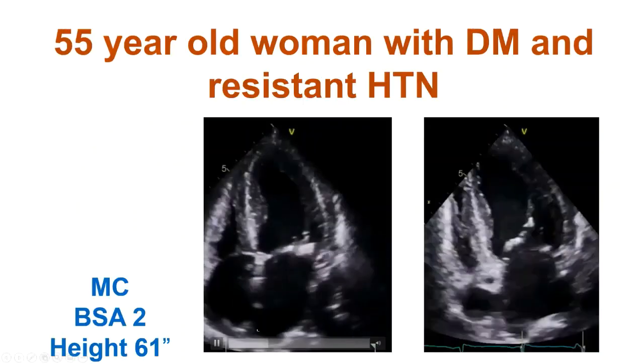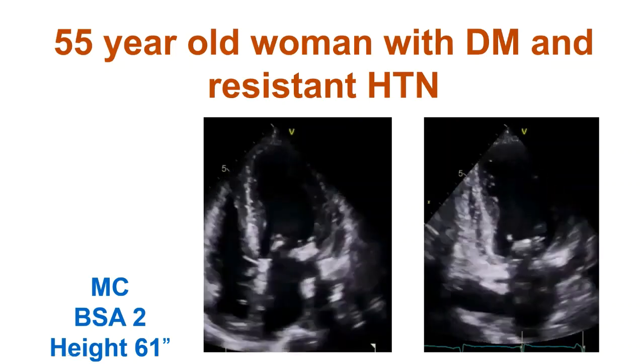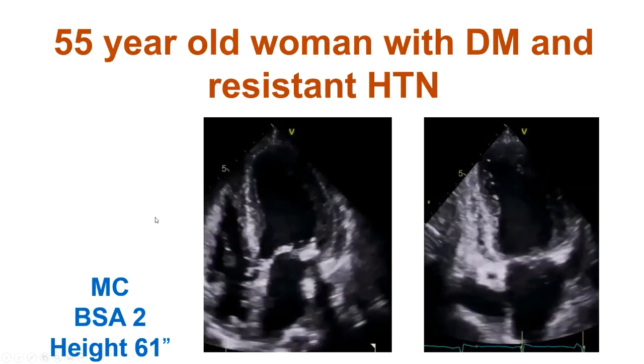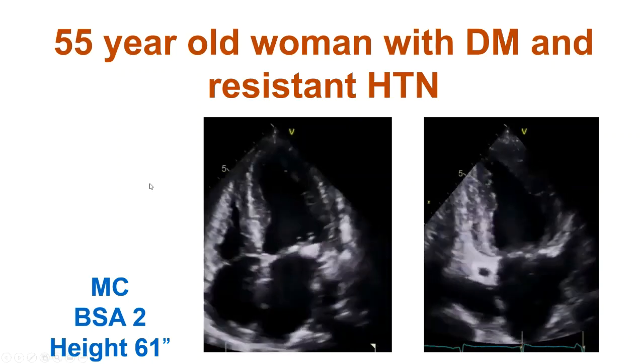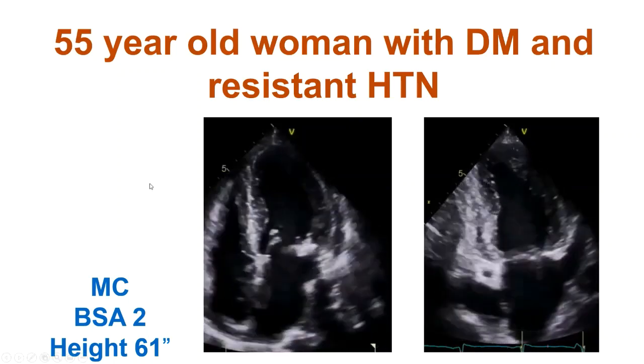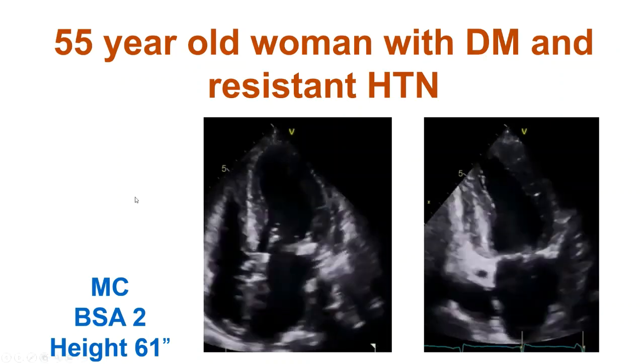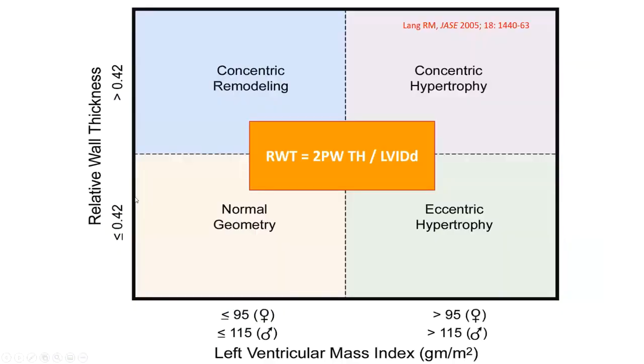So we'll talk for a second about how we arrive at left ventricular mass measurement. Here is an echocardiogram from somebody with longstanding hypertension. Resistant hypertension, also has diabetes. We have a body surface area of 2. So let's zero in on this terminology.